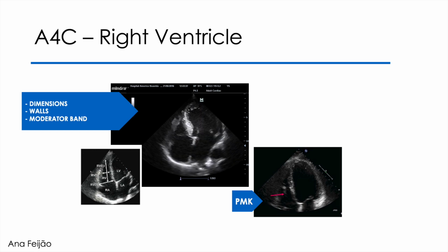I assess the contractility and thickness of the free wall. I always check that there is no heterogeneity in the thickness and echogenicity of the free wall. Beware of arrhythmogenic right ventricular dysplasia that easily goes unnoticed. And I also evaluate the inside of the ventricular cavity.